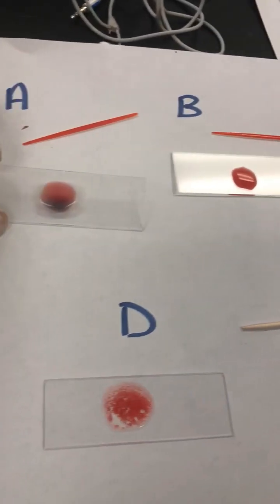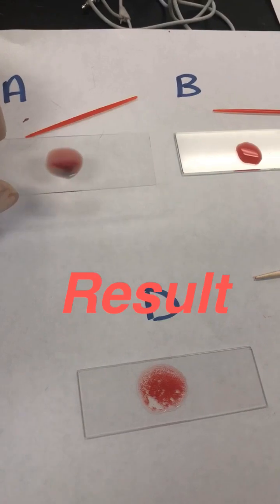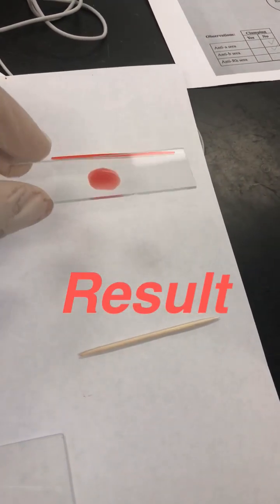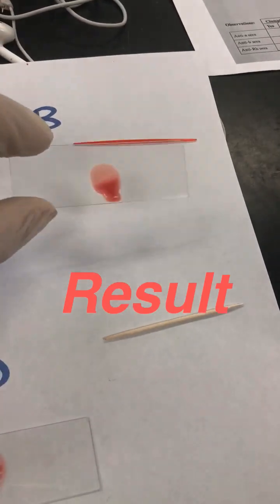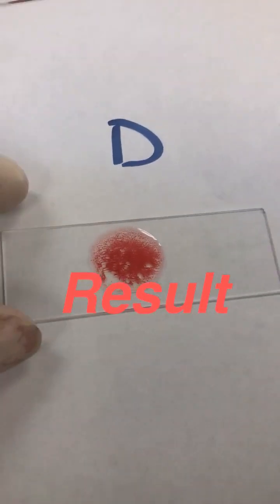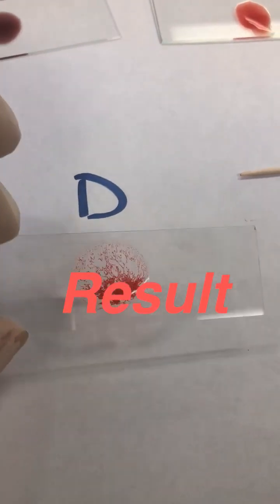There's no clumping. There's no clumping, so you don't have antigen A. No clumping on this one — you don't have antigen B either. And see this one? What happened? This indicates you have antigen D.